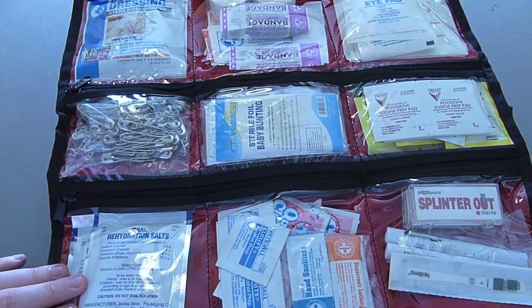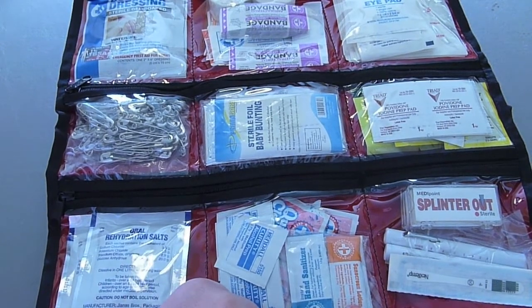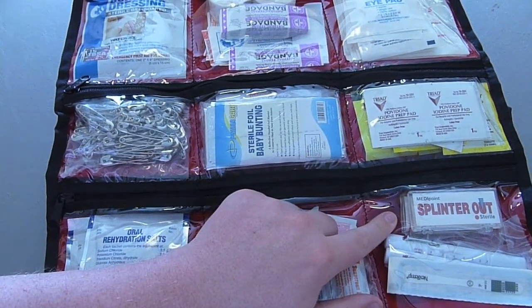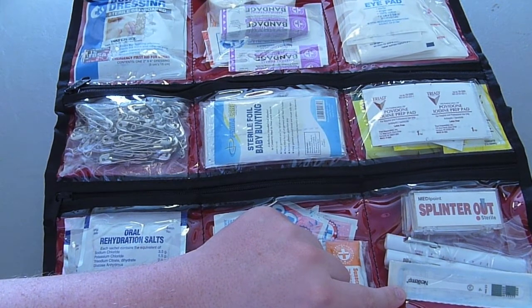Here we have some oral rehydration salts, alcohol prep pads and hand wipes, hand sanitizer, and sunscreen. Over here we have two cases of Splinter Out which are splinter removers, two normal pen lights, and a few disposable thermometers.